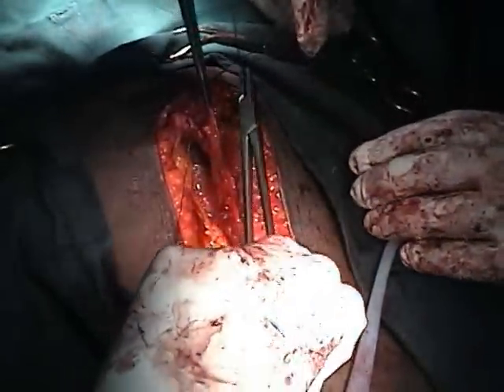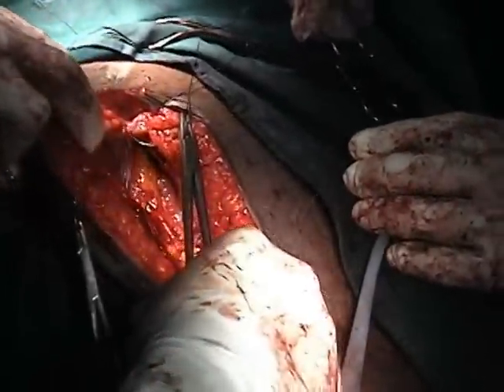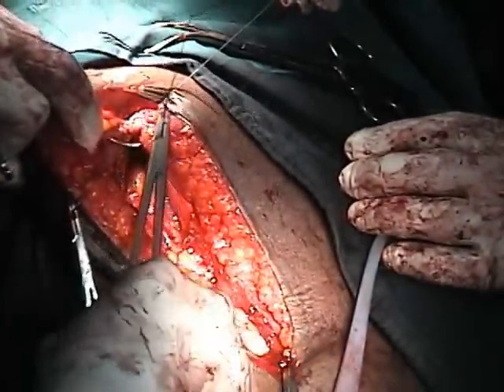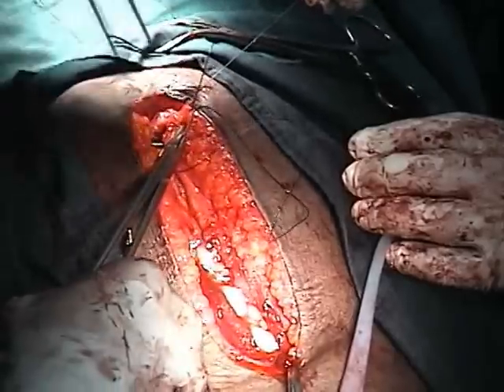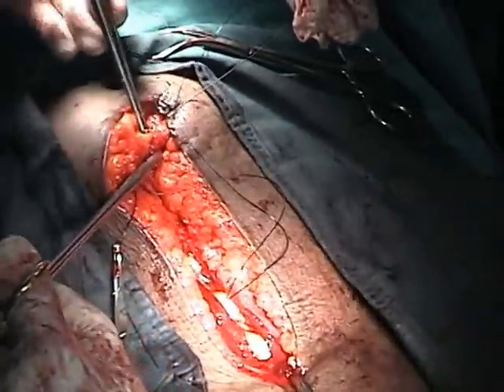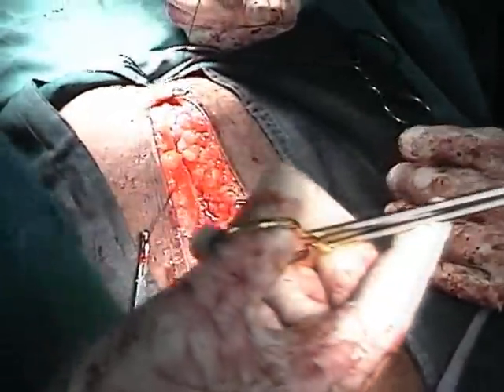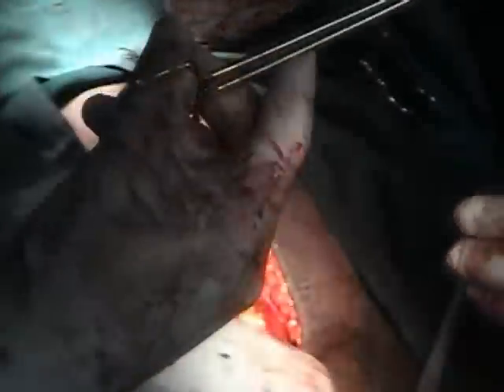So the upper angle of the rectus sheath is secured, and then the sutures are placed in the rectus sheath. And this goes all through the whole length of the incision.